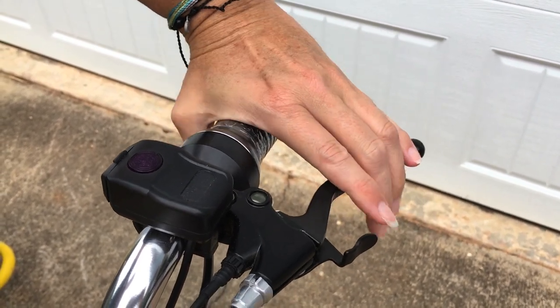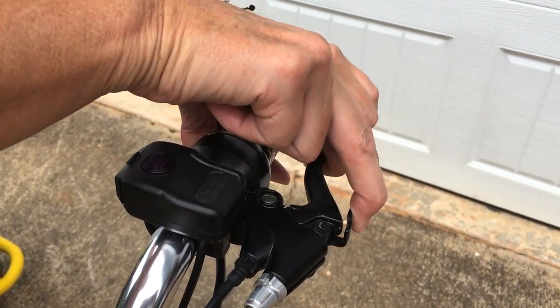When you go to get off the vehicle, make sure you turn it off, and then you'll want to lock the brake. Pull this lever back.